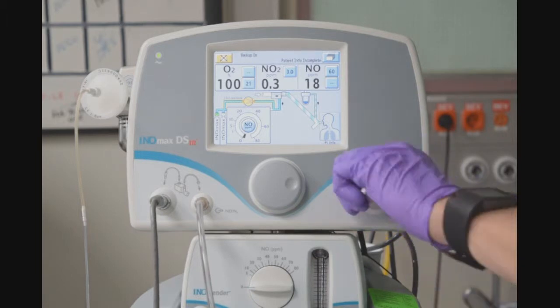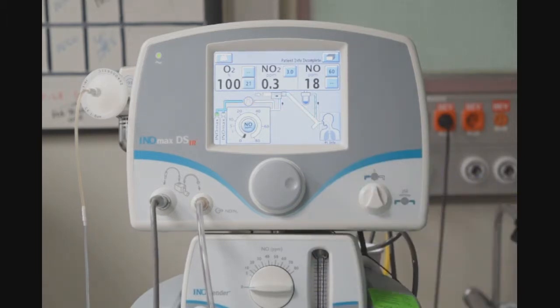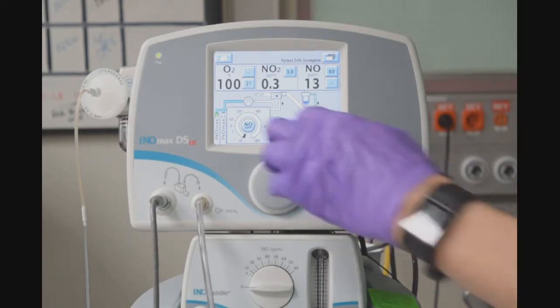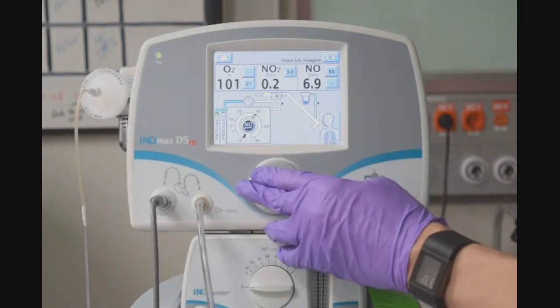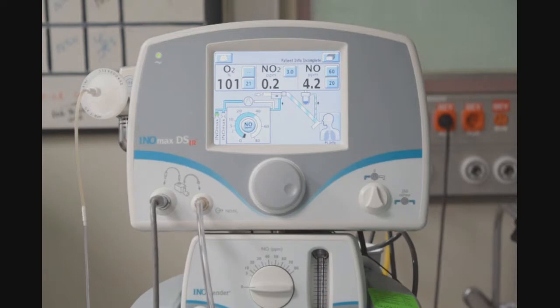Moving on, we will turn the backup delivery off. Next, we will complete the INLMAX DSIR performance test. Ensuring that my oxygen flow is still set at 10 liters, I will set the dose to 40 parts per million. We will wait for the values to stabilize.